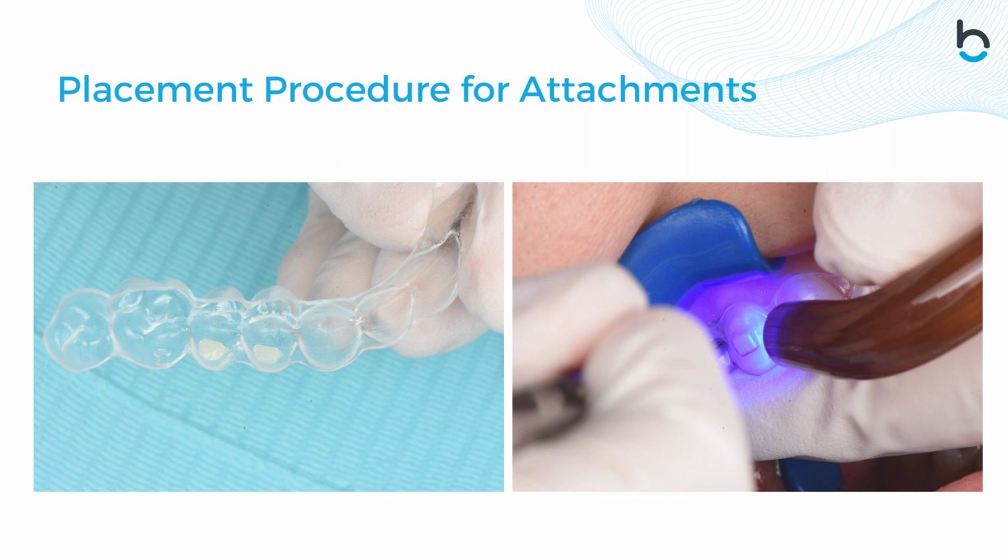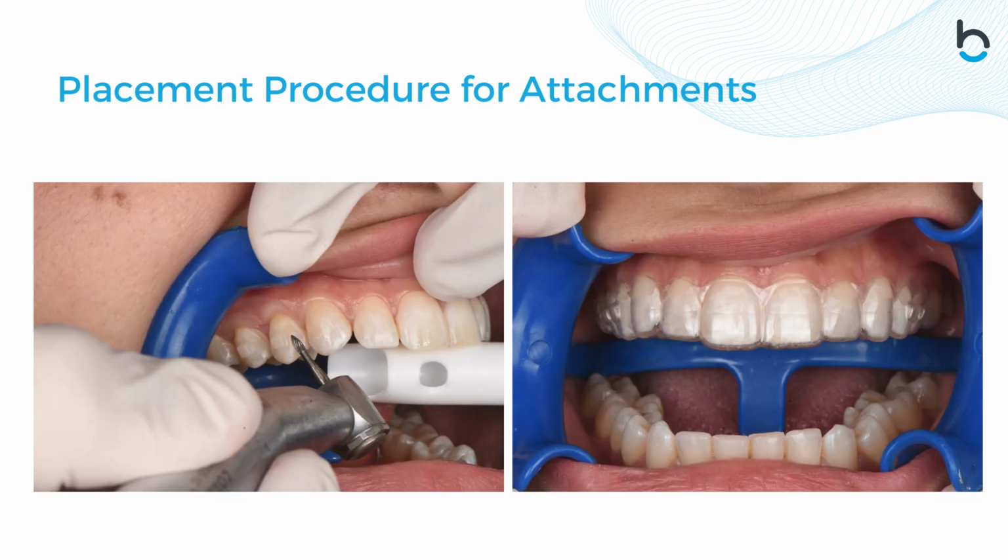Template seating and curing. Place the template back onto the patient's teeth and ensure it's firmly seated. The composite material inside the template pockets should be in direct contact with the tooth surface. Once seated, cure the composite using a dental curing light as per the manufacturer's instructions, solidifying the attachment onto the tooth.